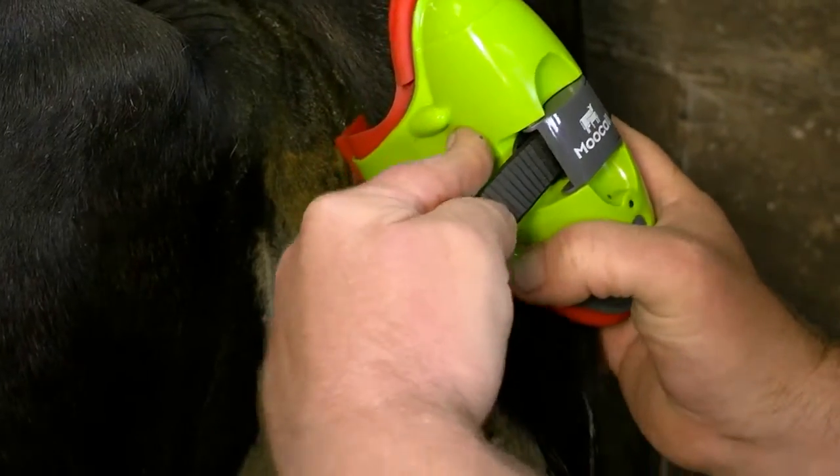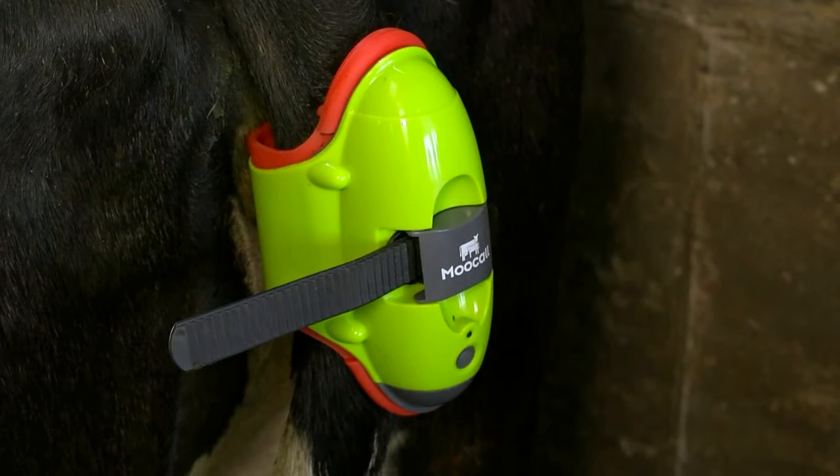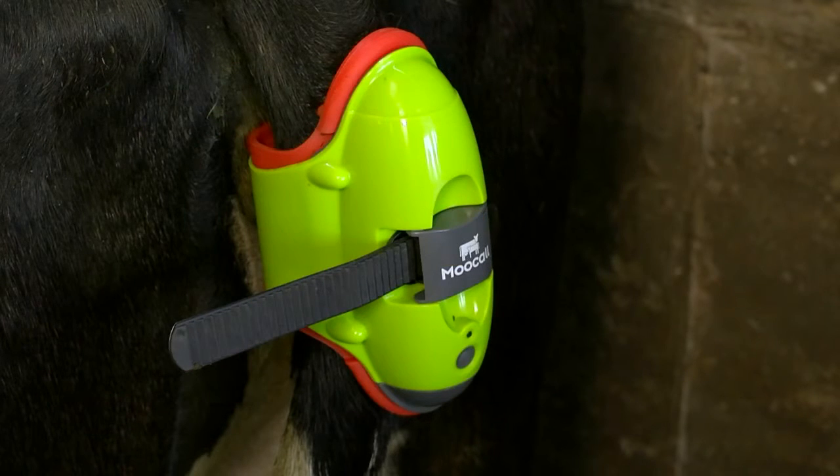Check that the sensor is secure by pulling it downwards on the tail. If it slides, pull the toothed strap an extra notch or two until you have achieved a proper fit. It is important that the sensor is not fitted too tight to the tail, as this may cause potential discomfort to the animal and lead to false alarms.